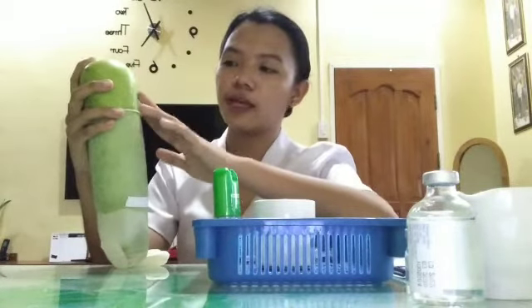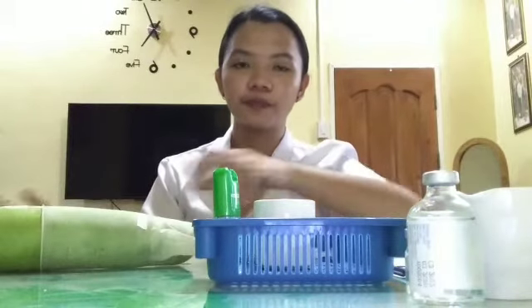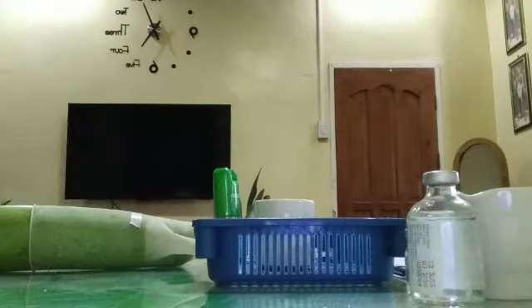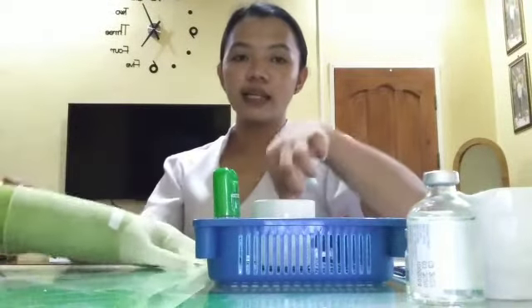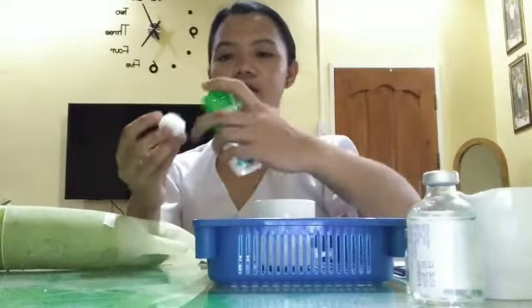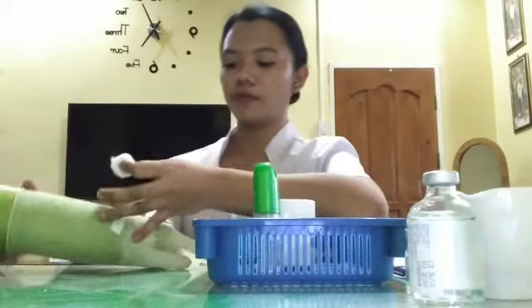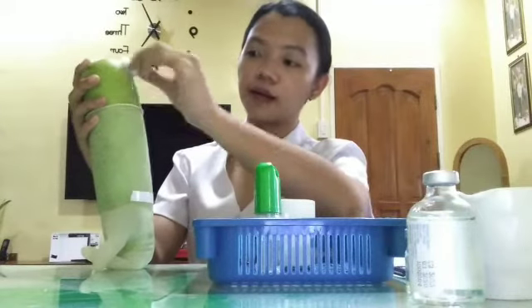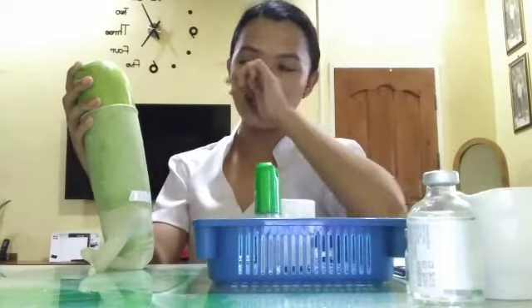So we will evaluate, and after evaluating we will clean it. Okay, so we'll be cleaning it with dry cotton and alcohol, from the center going outward, and then after that we'll discard the cotton.